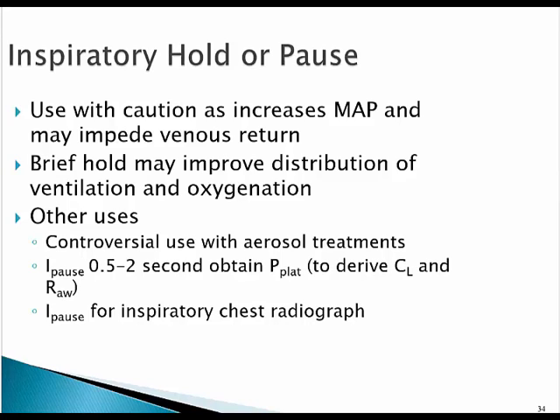Other uses, which are not routinely used, an inspiratory pause time of 0.5 to 2 seconds to obtain a plateau pressure so that you can calculate compliance and resistance, and also an inspiratory pause for chest x-ray. Again, you can do this with just the inspiratory hold button. You don't have to set a time on there to do that and then forget to take it off. Just use the pause button, the inspiratory hold button, and just do it temporarily. And that way we don't go off and forget to turn the inspiratory hold off.